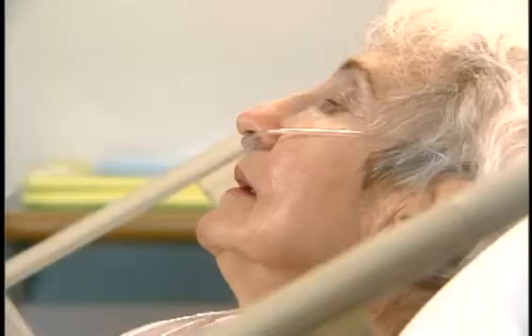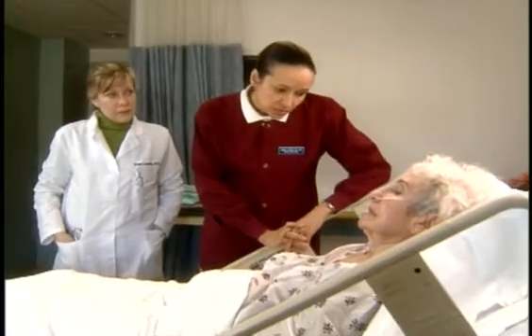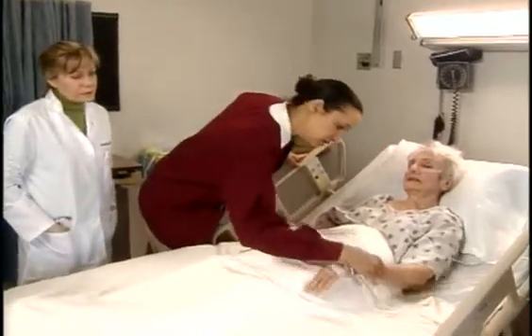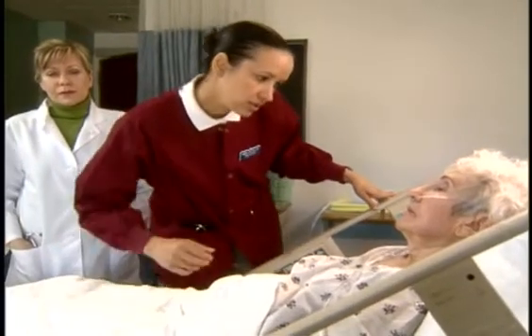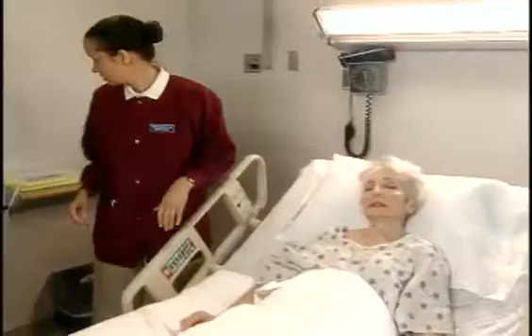Miss Marconi? Oh, hi, Anna. Hi. How are you doing? Okay, I guess. Okay. I'm going to help you get those secretions out of your throat. It'll be a little unpleasant during the actual suctioning. But once we're done, you're going to feel a lot better. This is my instructor, Miss Lewis, and she's working with me today. Hello, Mrs. Marconi. We're going to help you breathe easier. Okay, let me just take a look at your ID band. And can you tell me your name? Julia Marconi. Okay, just give me a moment to set up, all right?